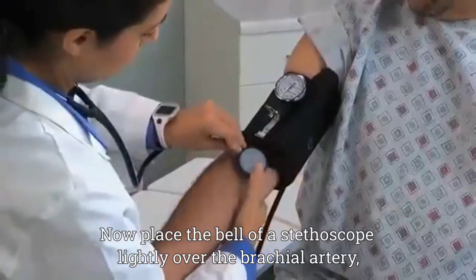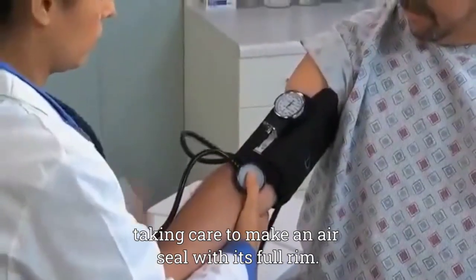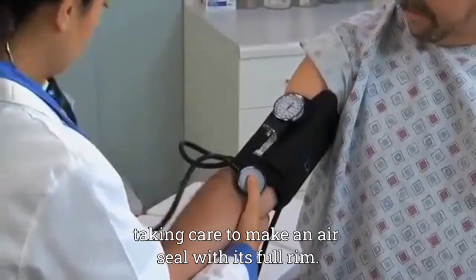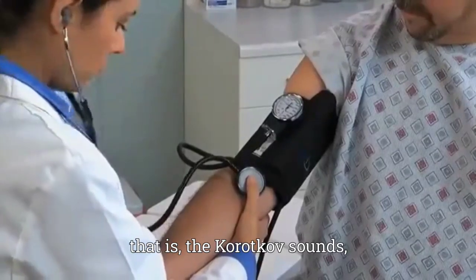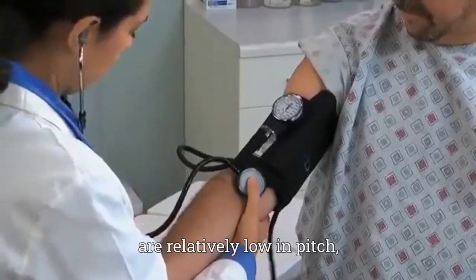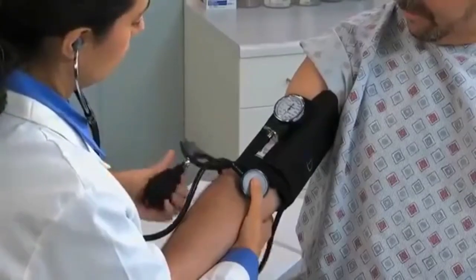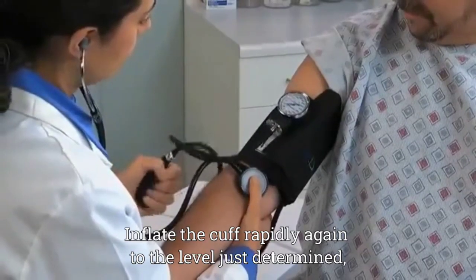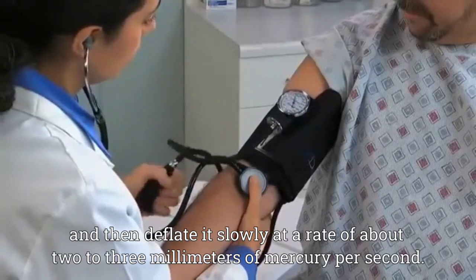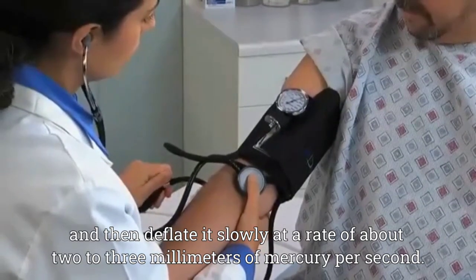Now place the bell of a stethoscope lightly over the brachial artery, taking care to make an air seal with its full rim. Because the sounds to be heard, that is, the Korotkoff sounds, are relatively low in pitch, they are generally heard better with the bell. Inflate the cuff rapidly again to the level just determined, and then deflate it slowly at a rate of about 2 to 3 millimeters of mercury per second.